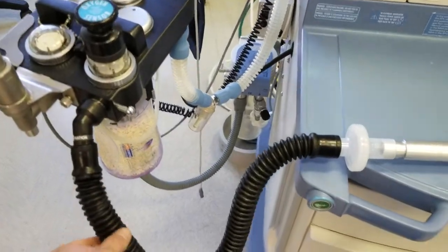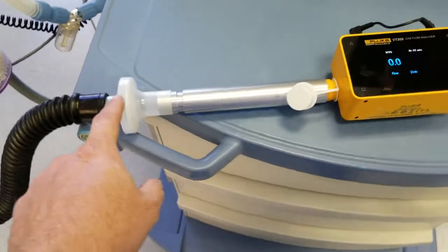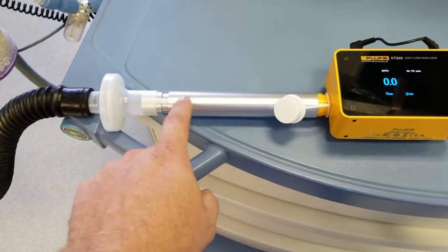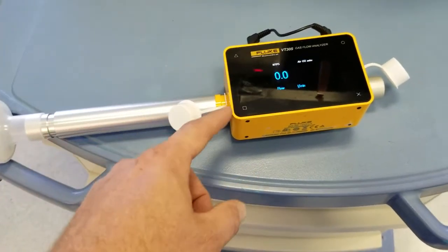I have hooked a hose from the inspiratory valve across through the filter. You always want to make sure you use the filter to keep any dust or particulate out. This is the VT305 and the expansion tube, which will let the air expand out and won't give a direct shot across the sensors.